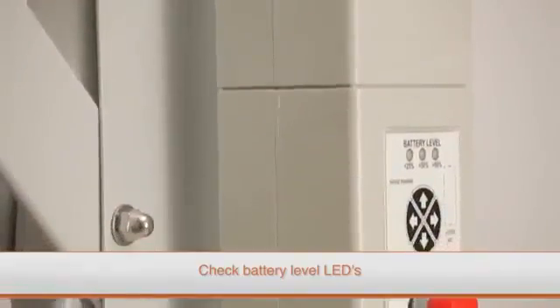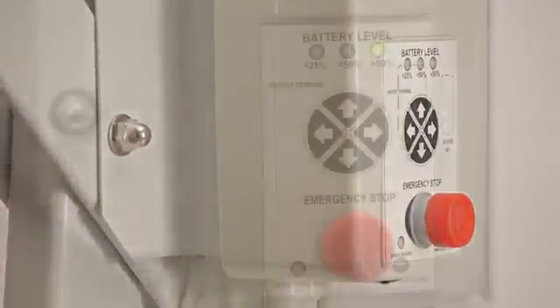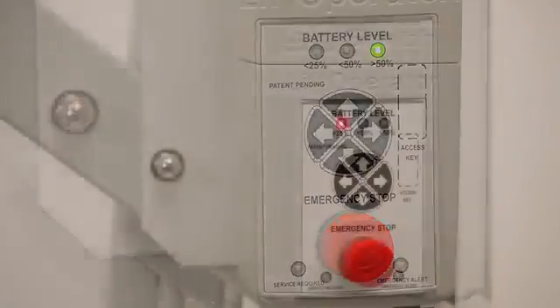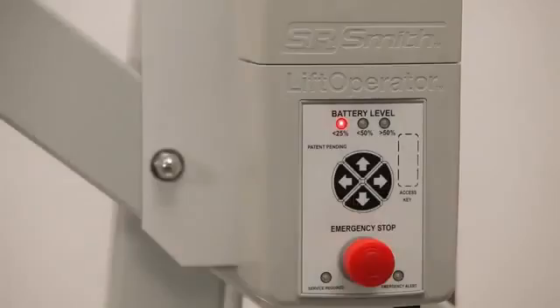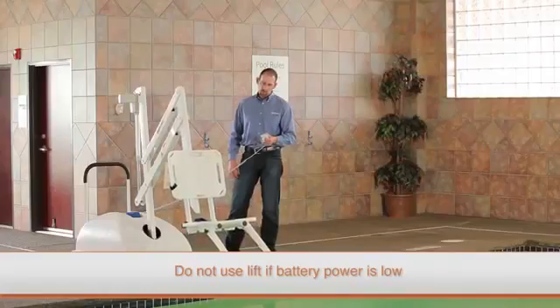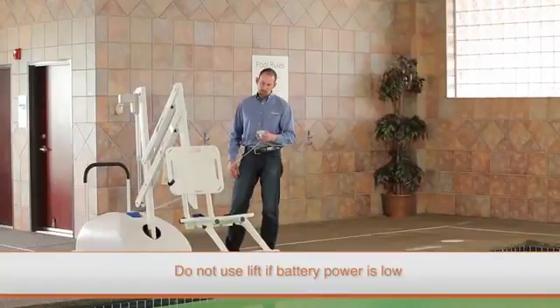Next, check the battery level LEDs on the front of the control box. A fully charged battery pack will illuminate green and above 50% on the LED. If the battery is showing less than 25% and the red LED is lit, do not use the lift as the battery may not have enough power for a full operation.